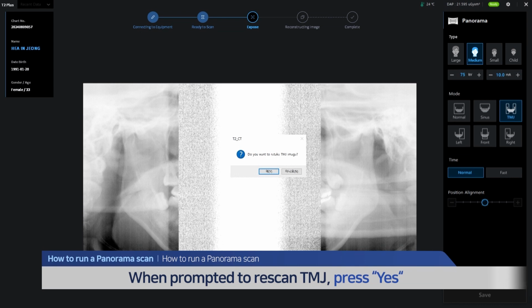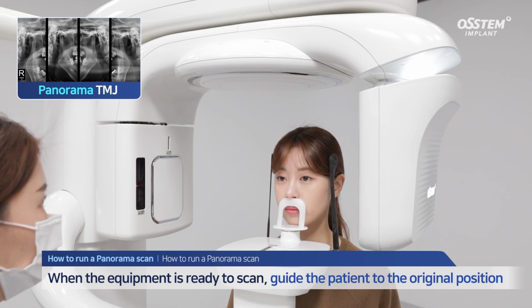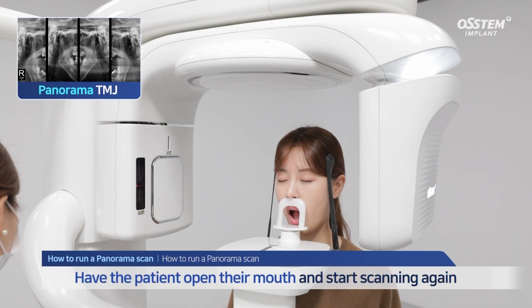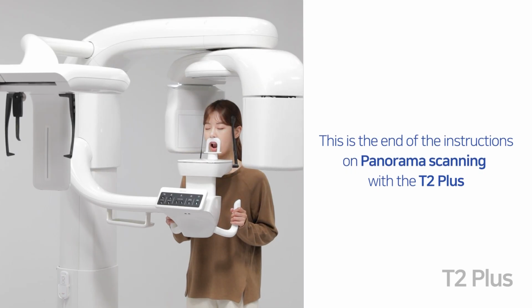When prompted to rescan TMJ, press yes. When the equipment pauses its operation, position the patient in the same manner as before. Then, have the patient open the mouth and start scanning one more time. This is the end of the instructions on panorama scanning with the T2 Plus.